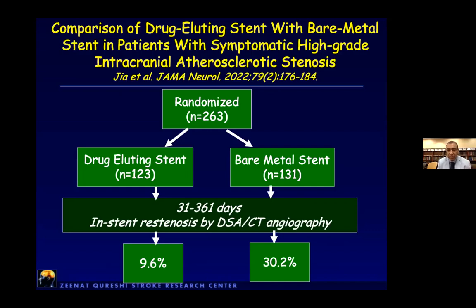And the explanation may be in-stent restenosis. So obviously restenosis can occur. And the purpose of drug-eluting stent is to actually elute, which is to release the drug over a period of a month into the arterial wall. And these drugs are antiproliferative agents, meaning that the antiproliferative agent that diffuses into the arterial wall prevents proliferation, which is the basis of restenosis.